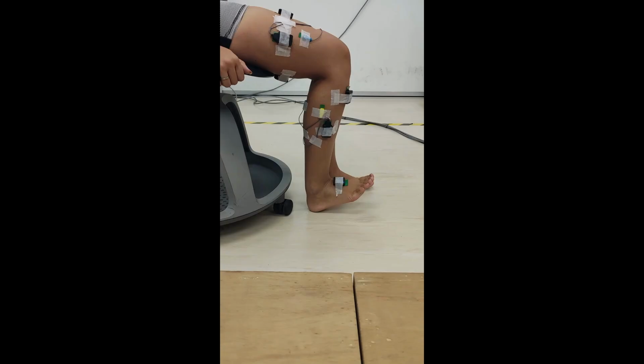Number 12 is collecting the maximum voluntary contraction, or MVC, for the EMG signals. In the MVC, we ask subjects to maximally contract or tense a certain muscle group to collect a maximal baseline or benchmark. All the other EMG readings can then be normalized against this benchmark so that they can be obtained as a percentage of the maximum.